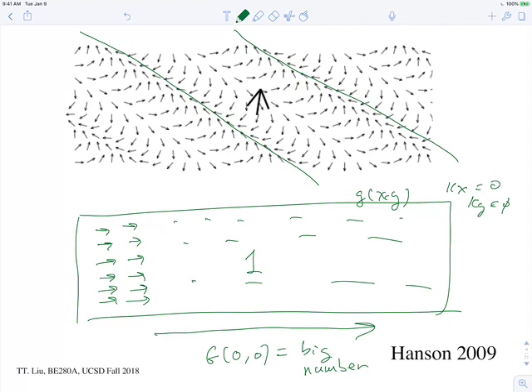If you think about adding up all these vectors, this spin here is going to cancel out this spin here when I do the vector addition, because it's pointing in the opposite direction. So those two are pointing in opposite directions, and there's going to be a lot of cancellation at this value. So when I do the summation, I expect to get a very small vector sum. For example, this is g at some value kx, ky, and this is going to be a small number. That makes sense because my object is uniform, so it's not a good match for a diagonal pattern. So that's what the process looks like if I have a uniform object.